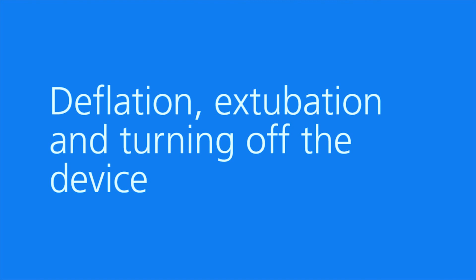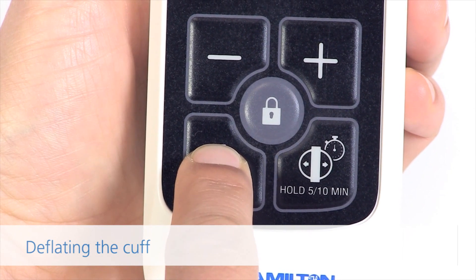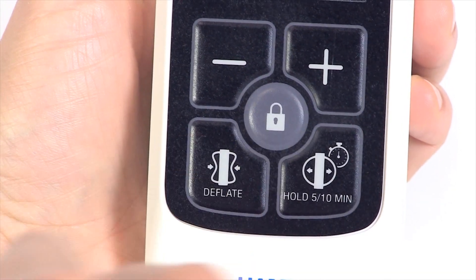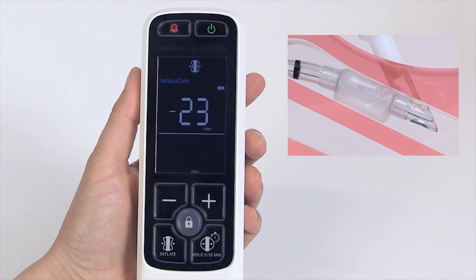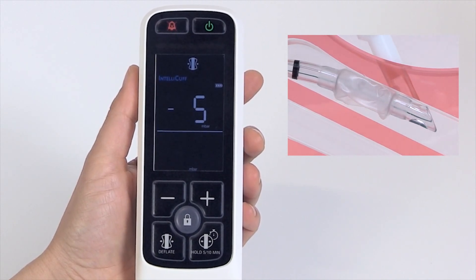Deflation, extubation and turning off the device. Deflating the cuff: long press the deflate button. The device applies negative pressure until the current pressure is zero. During that time, the cuff is actively deflated.